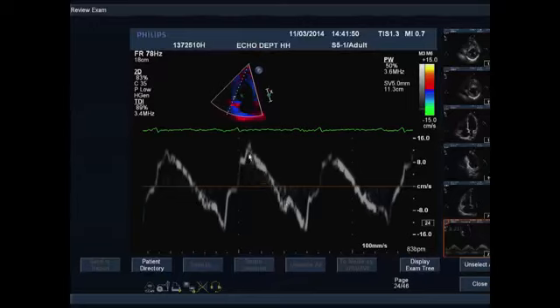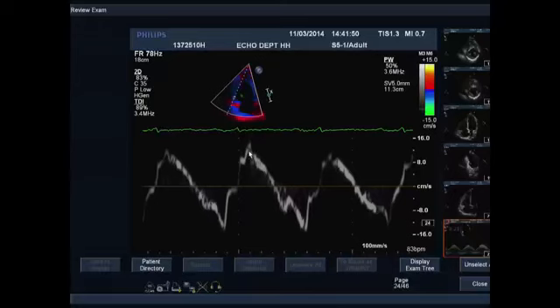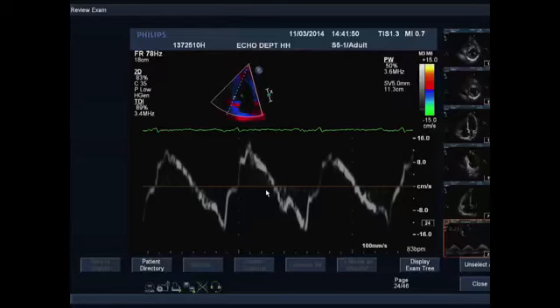It's also important to mention that the peak velocity is called systolic S-wave velocity, and it's prognostic in patients with pulmonary hypertension. The systolic S-wave velocity has a normal cutoff value less than 11.5 centimeters per second. And as you may see, in our patient, the systolic S-wave velocity is 12 centimeters per second, which means borderline normal. Even though we should bear in mind that TDI is influenced in patients with atrial fibrillation, and that's why we should take 3 consecutive measurements when we have patients with arrhythmias.